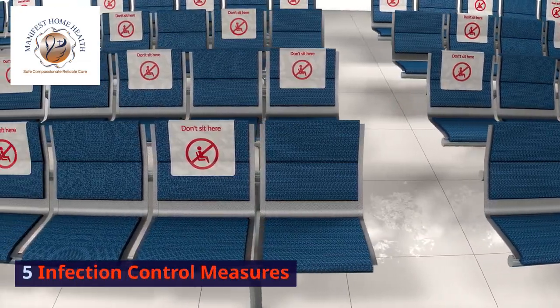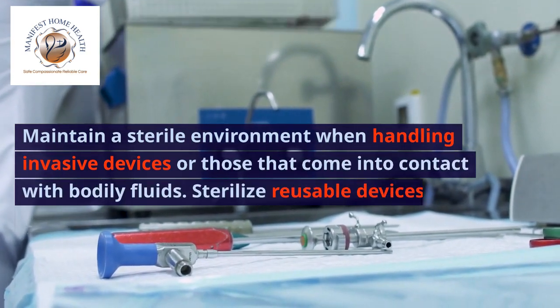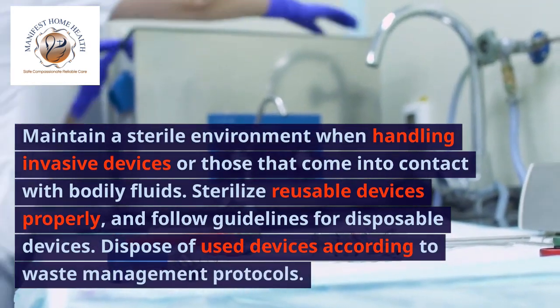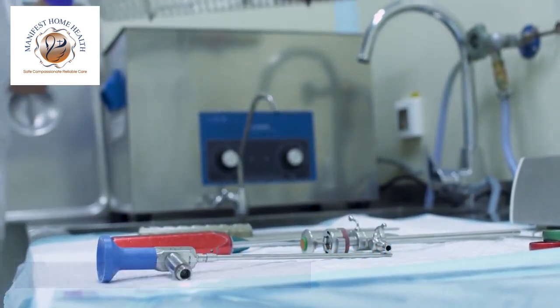5. Infection control measures. Maintain a sterile environment when handling invasive devices or those that come into contact with bodily fluids. Sterilize reusable devices properly, and follow guidelines for disposable devices. Dispose of used devices according to waste management protocols.